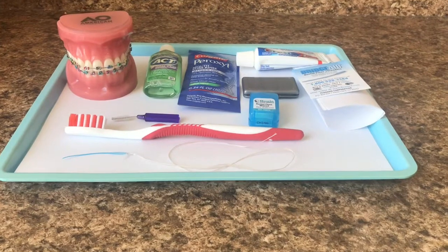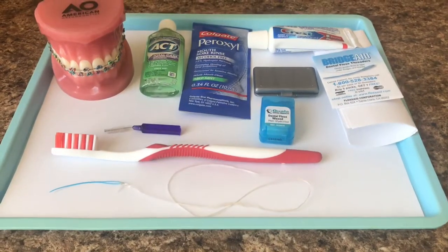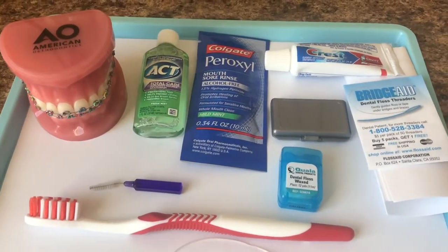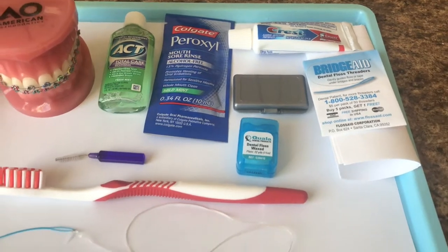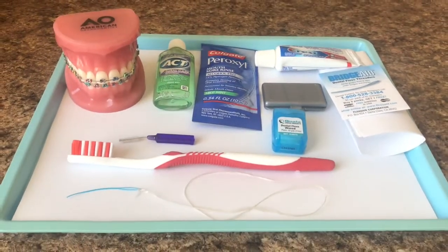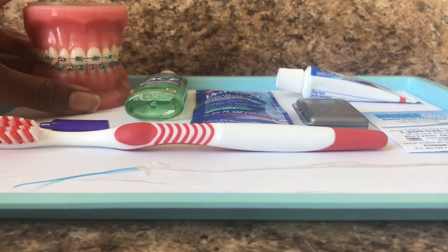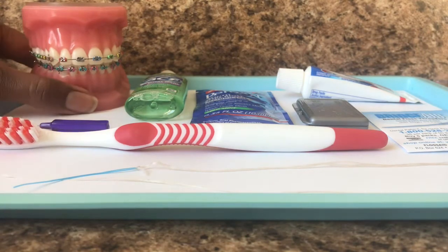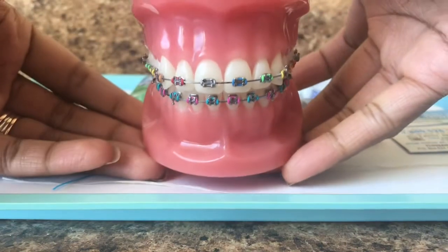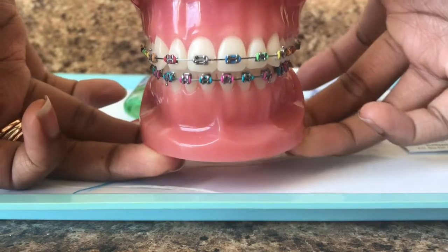So before patients leave after getting their braces at their bonding appointment, we do give them a bunch of goodies and a water bottle, and here is everything that will be enclosed in the water bottle. We will go over every item with the patient and show them how to use each item. We use this typodont that I have here in order to demonstrate how to use each item.